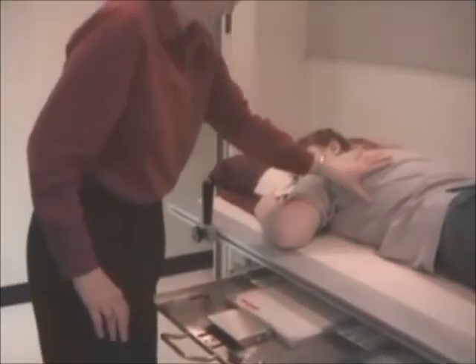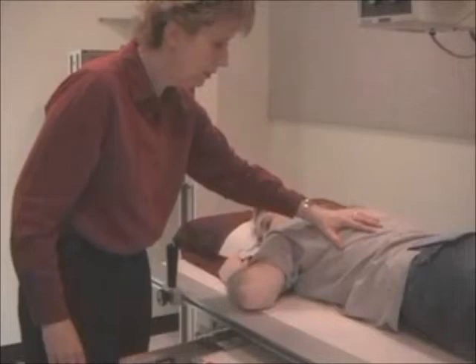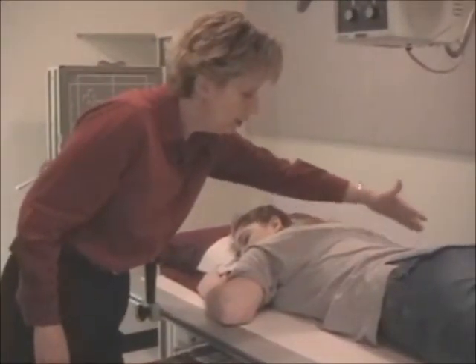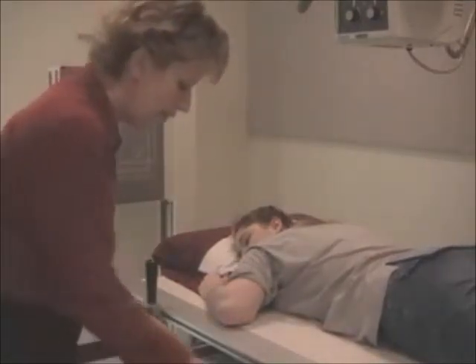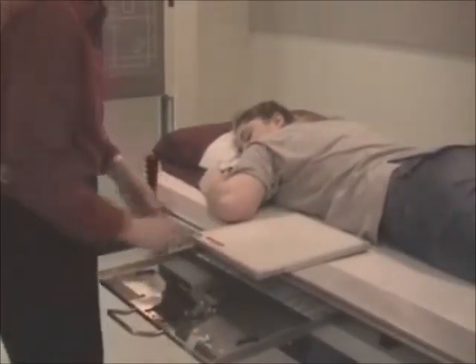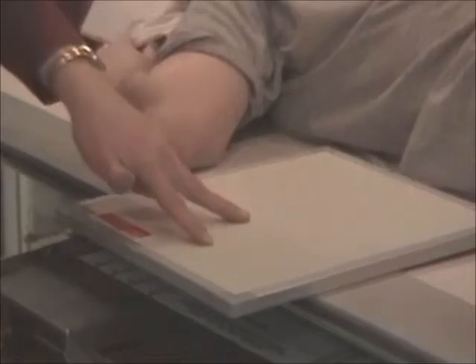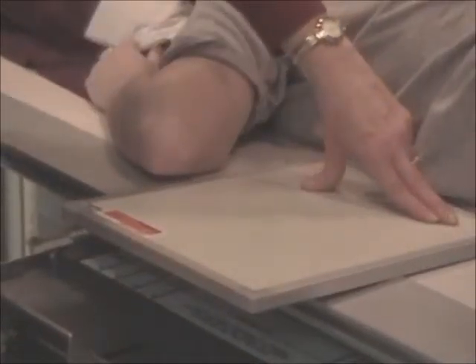And here's her left side. The fundus of the stomach would be here, and then the body and the pylorus comes to the patient's right side. So if we track that on a film, I want you to look here for a second on the cassette. Fundus is on the left side, and it circles around into the body, and the pylorus ends up over here.